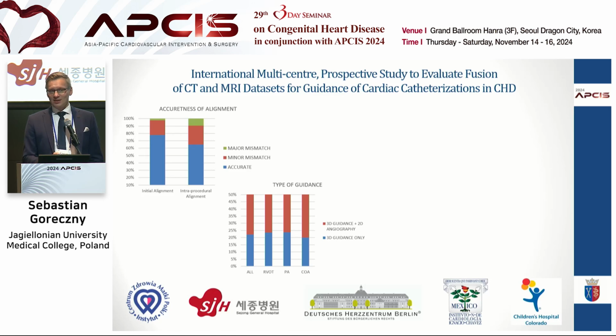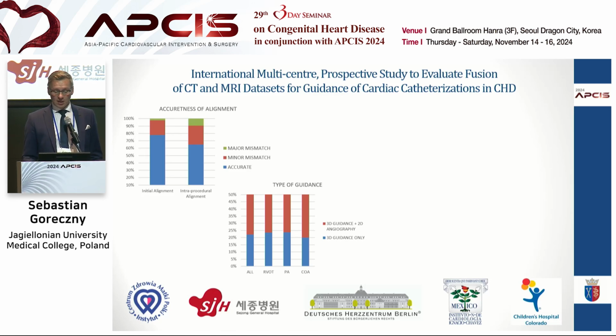Then this is a true blueprint for me, whether someone really believes in that imaging: the fact that you just used 3D imaging and no additional contrast, which means that you have proper alignment and you really believe in what you have on the screen. And you can see that overall, over 20% of cases were done without prior contrast injection. So all that imaging that was done before bringing a patient in the lab actually translated into interventions without contrast. Contrast was injected to assess outcomes.